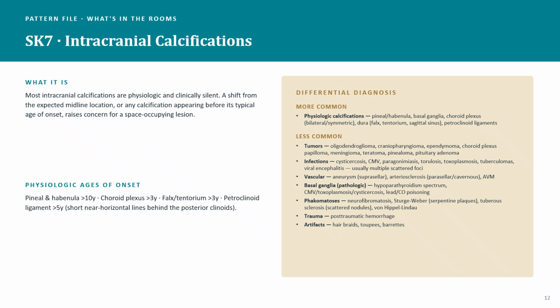When we have these abnormal calcifications, they can sometimes be associated with a patient having blood vessel problems. There can be some underlying disease. There can be infection. Also, there can be tumors associated with these calcifications.